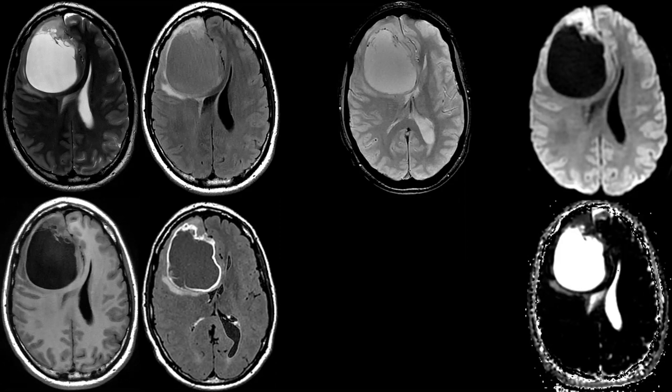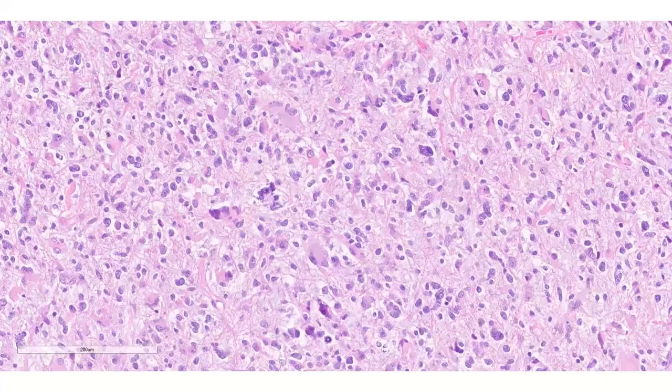On the far right top is diffusion weighted imaging. Look at the cap, the very top, the most rostral in the frontal area of the cyst. See how hyperintense it is on the DWI. And then if you go down to the bottom, just below it, that is the apparent diffusion coefficient map, the ADC map. Do you see how that bright signal is now dark? Hypointense, that confirms that the hyperintensity on the DWI is not T2 shine through, it is restricting diffusion. Okay, all right, and let's look at the histology.